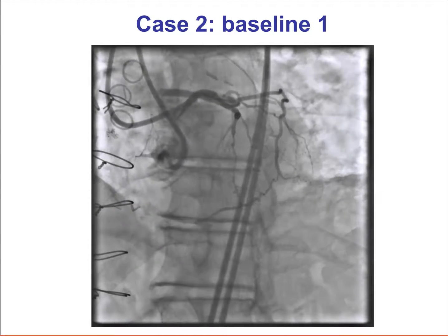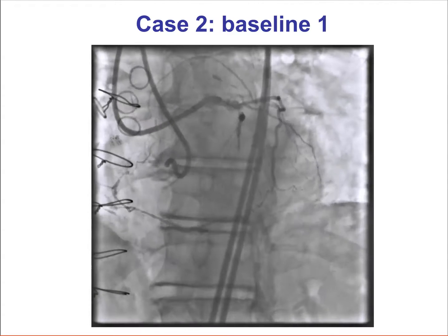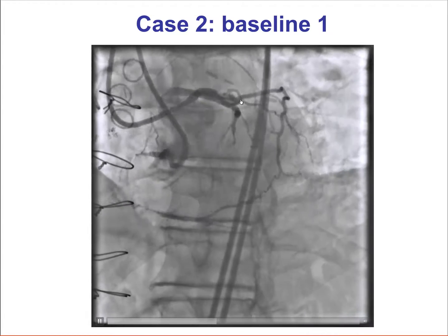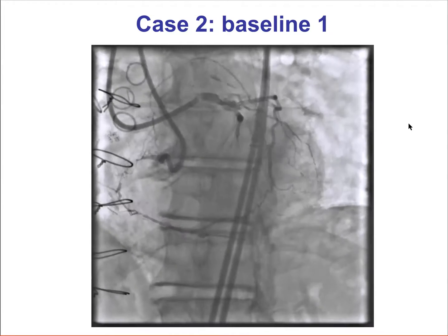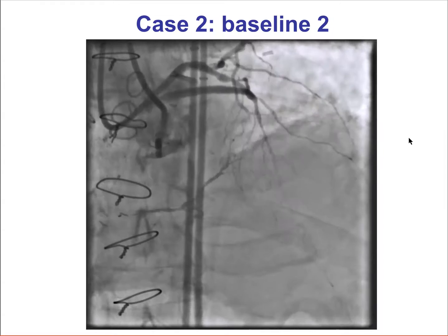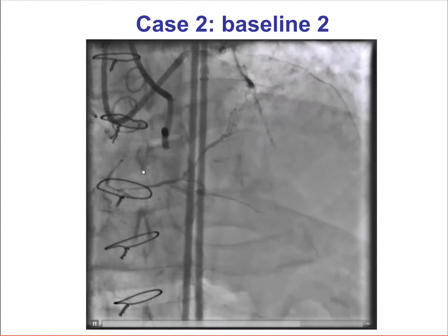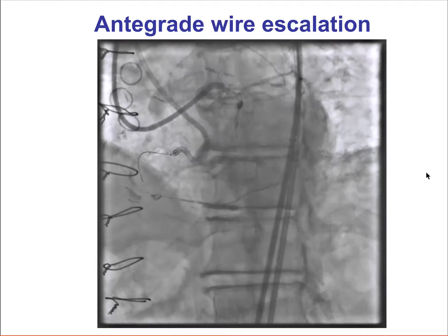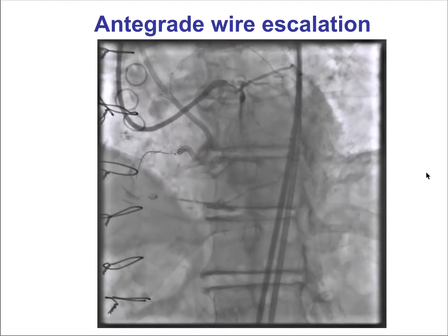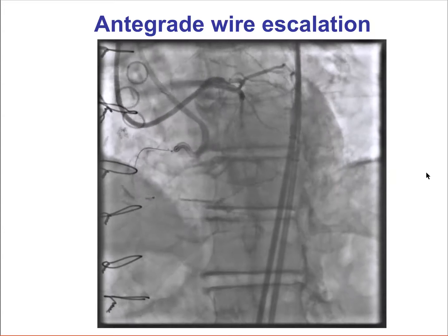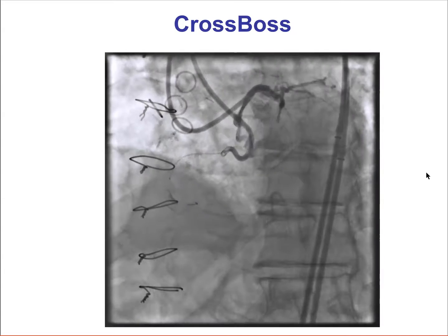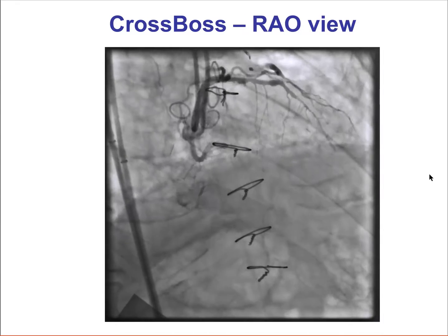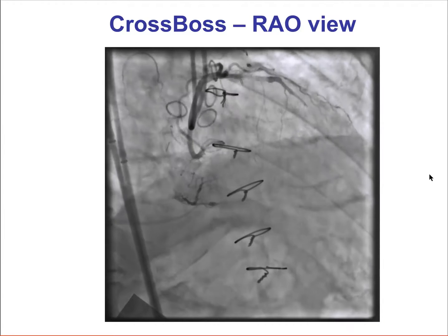Moving to the next case — also a dissection reentry case in a proximal right coronary artery. The vessel is engaged with an AL1 guide and the contralateral vessel with an XP 3.5 guide. This is an LAO cranial projection showing a short occlusion but with a very tortuous right coronary artery. Initial attempts with wire escalation did not succeed in crossing. The guidewire can be seen in an acute marginal branch or in the pericardium. We then attempted to cross with the CrossBoss, which appeared favorable in one view, but in an orthogonal view appeared to be in a side branch.